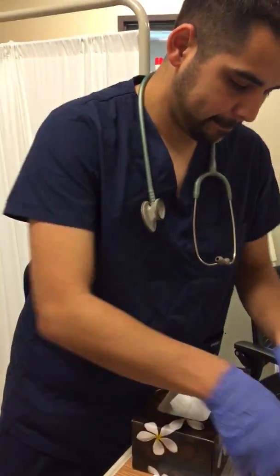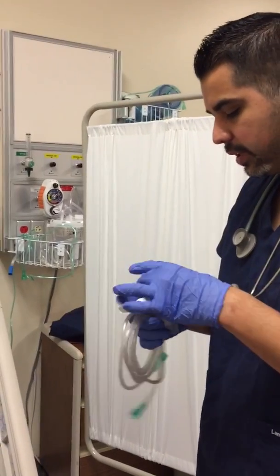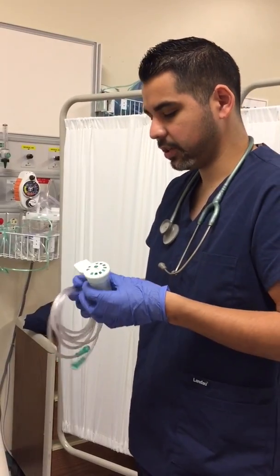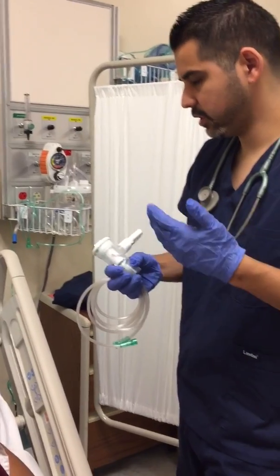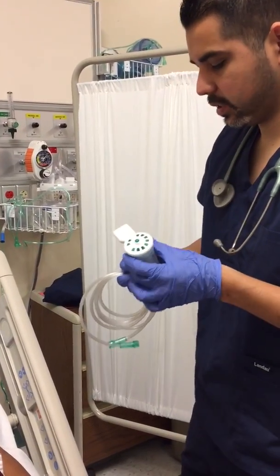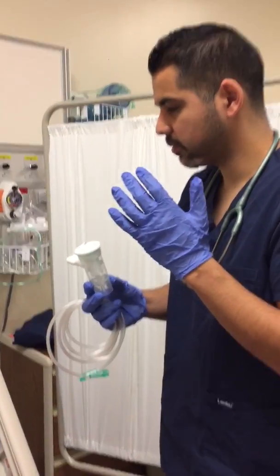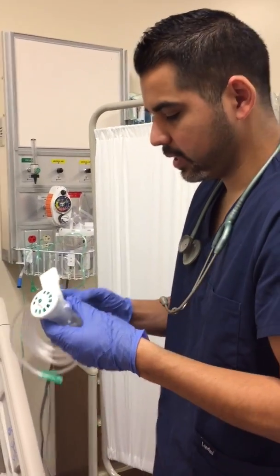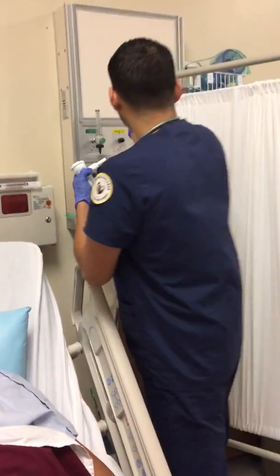Now I'm gonna be giving you medication right now. Okay, so I'm just gonna let you know that we're gonna be giving you again the DuoNeb. I'm gonna put this inside here, and then what you're gonna do for me is wrap your lips around this, and you're gonna inhale for me really slow and deep and normally. So like I said, if you feel like the drug is getting to your eyes, I want you to close them for me. Or if you can't do that, I'll keep them closed. I can put a towel over your eyes. Okay, all right. And then what you're gonna do is, yeah, just wait a second. I'm just gonna pop this in.